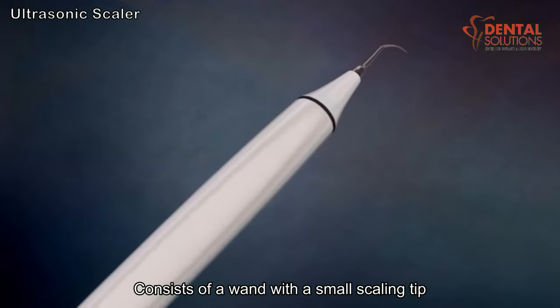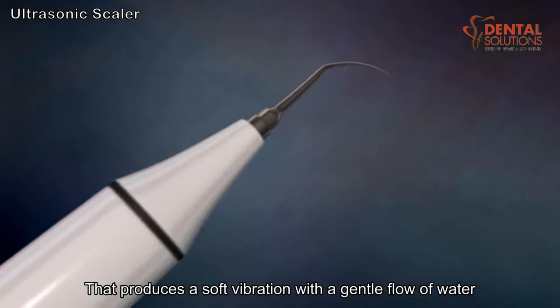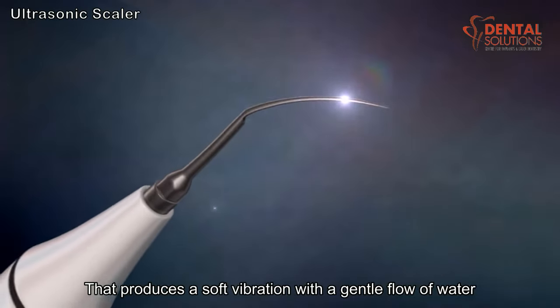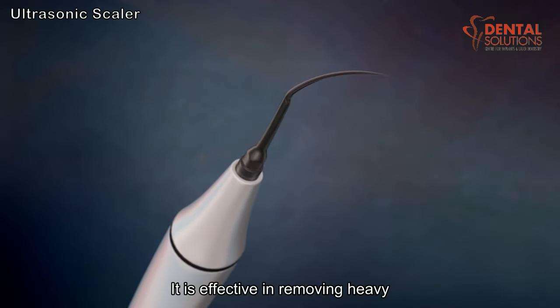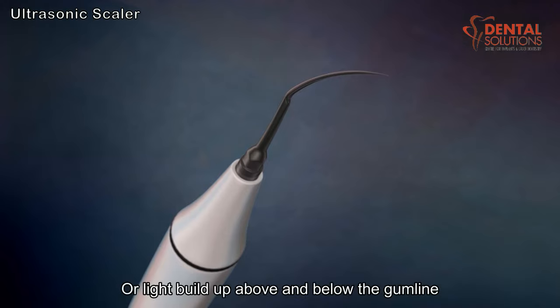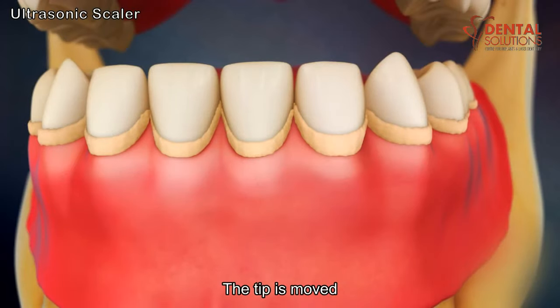The ultrasonic scaler consists of a wand with a small scaling tip that produces a soft vibration with a gentle flow of water. It is effective in removing heavy, moderate, or light buildup above and below the gum line. The tip is moved slowly along the tooth surface and gum line.